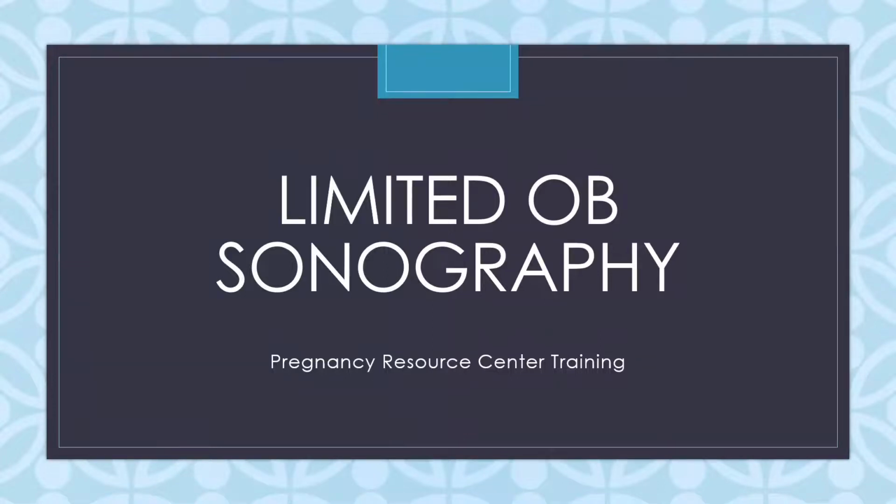This is a limited OB sonography training for nurses that are scanning in the pregnancy resource centers. Now, some of this training may be a little different from site to site. So if some of the policies and procedures at your institution that you're going to be volunteering at differ, then you'll need to speak with your ultrasound coordinator about that.